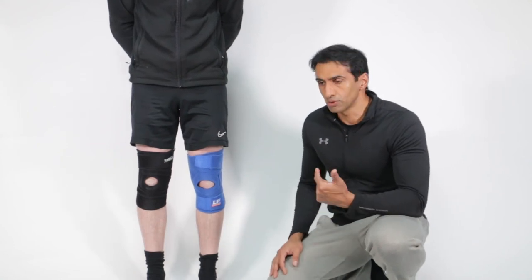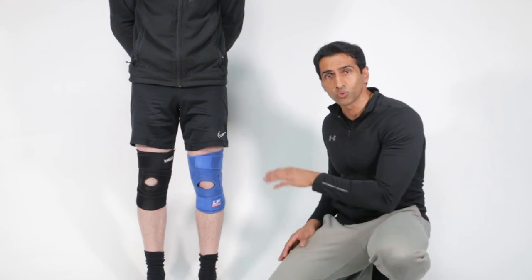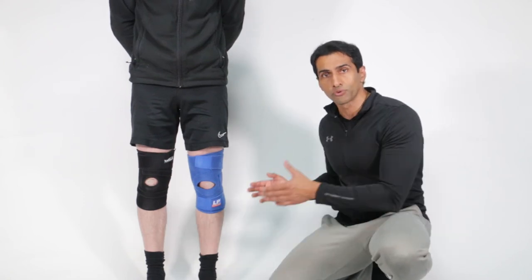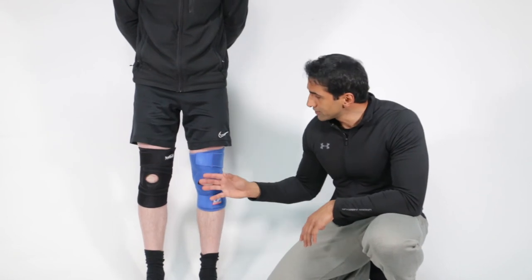If you're thinking about exercising, doing sports, or moving a lot, the last thing you want is to have it constantly on your mind. Having to constantly adjust it is unfortunately the biggest flaw in a three-strap system. The four-strap system also provides a fantastic 360-degree wraparound support as a result.